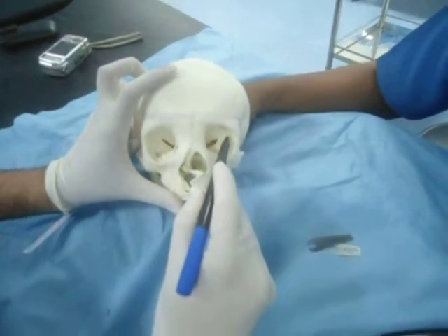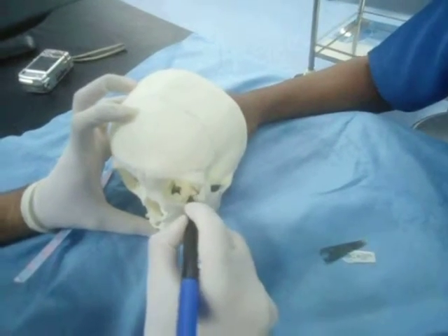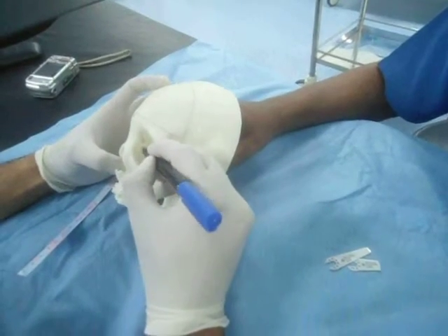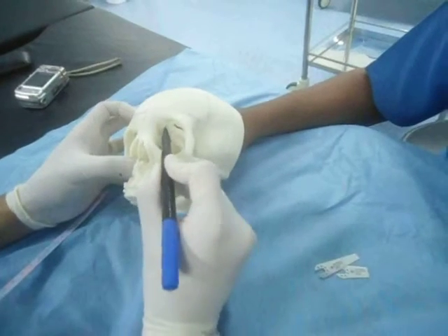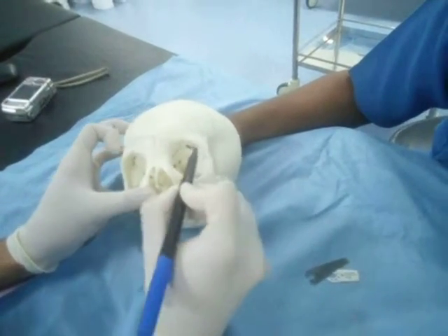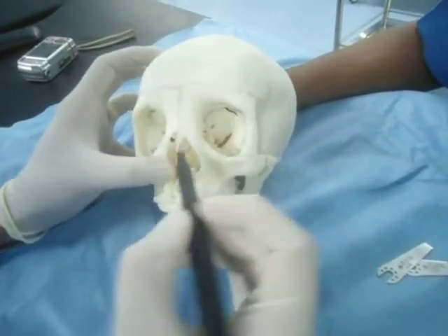The lateral osteotomy will come at the level of the inferior orbital fissure and then through the base or the floor of the orbit, and then connected behind the lacrimal apparatus into the nasal bone, and then connecting the supraorbital, the orbital roof osteotomies. This is the orbital osteotomy on one side.